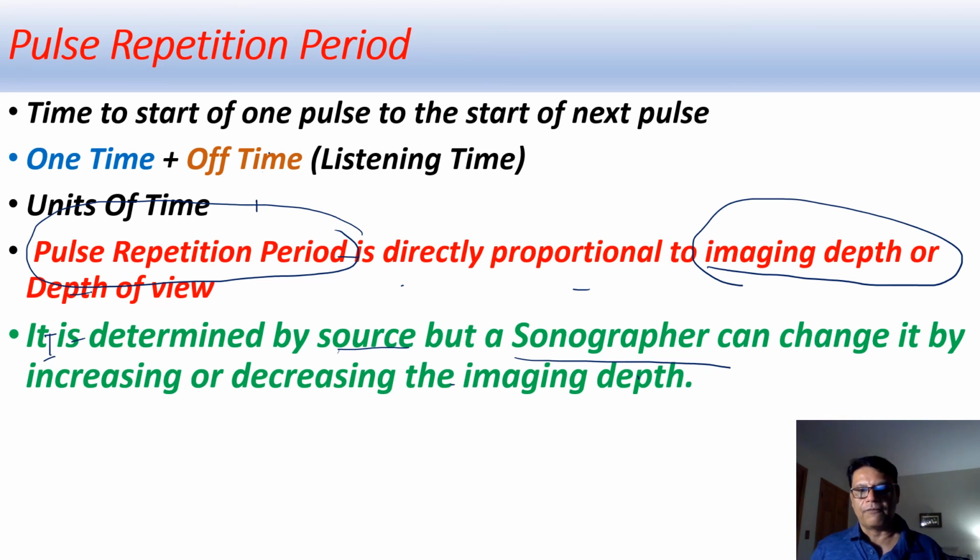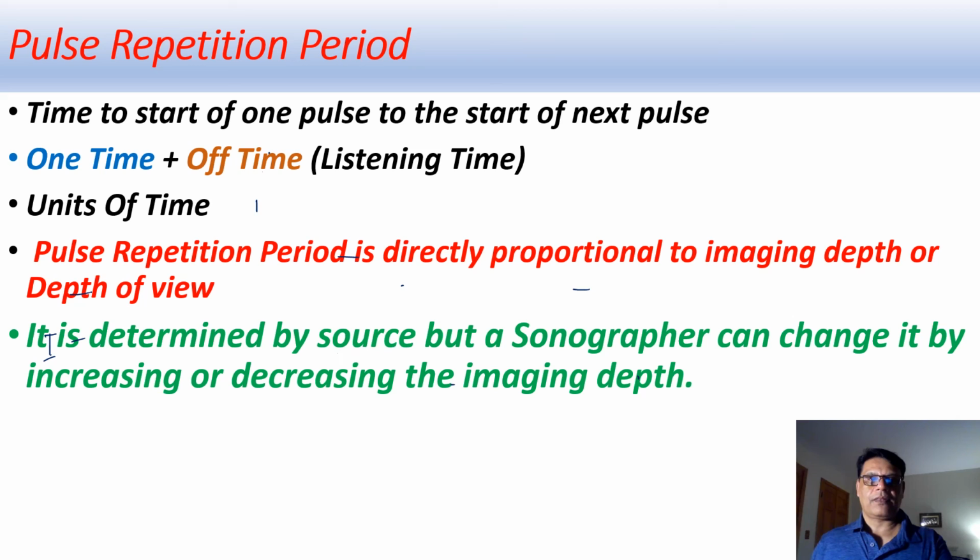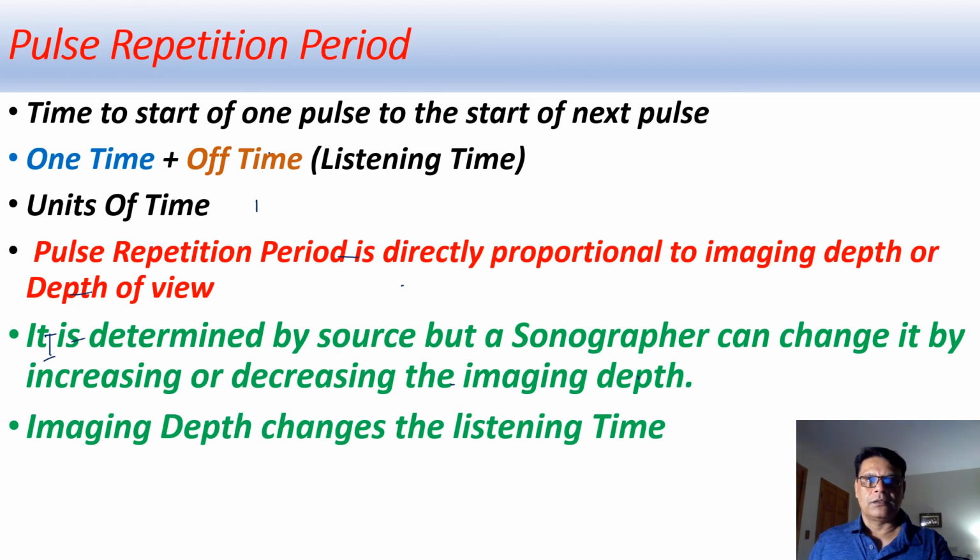So when a sonographer changes the imaging depth, he is actually changing the pulse repetition period. Let's see how. Imaging depth changes the listening time or the off time.